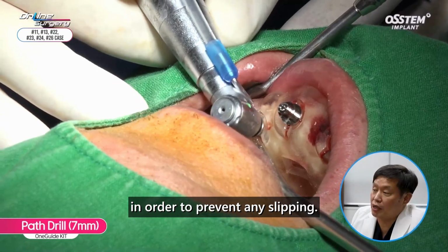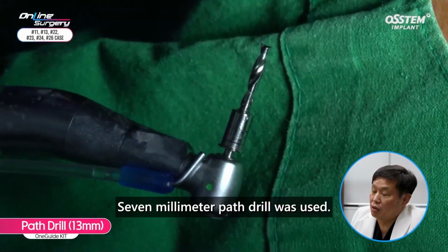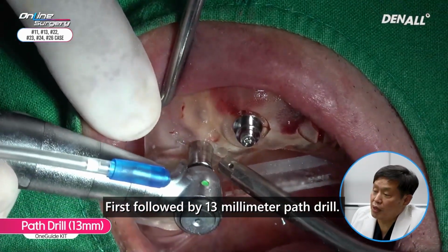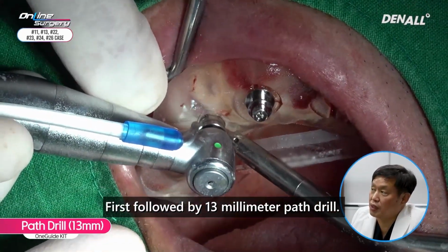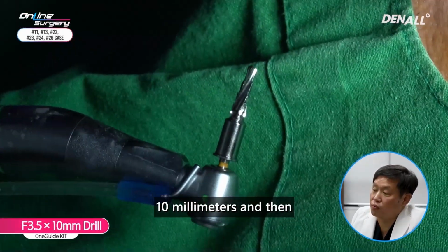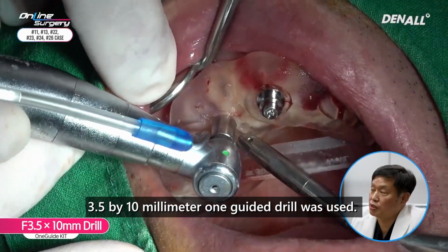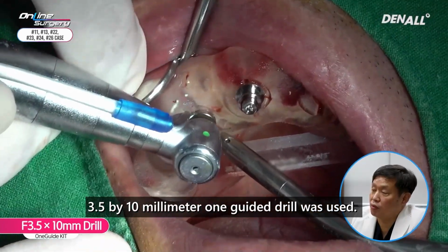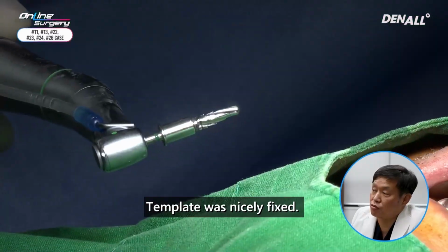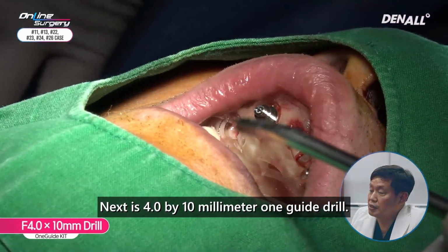In order to prevent any slipping, path drill was used. 7 mm path drill was used first, followed by 13 mm path drill. In the canine area, path drill was used up to 10 mm, and then 3.5 by 10 mm OneGuide drill was used. Template was nicely fixed. Next is 4.0 by 10 mm OneGuide drill.